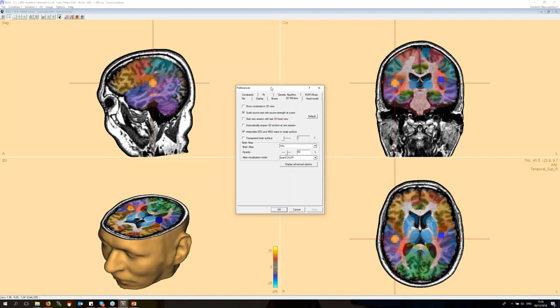And of course, there's a challenge now with the visualization that we have. On the one hand, the source image that we're showing in this brain, and on the other hand, we have the atlas overlay. So we could change the opacity here. We can, for example, put it down to 25%, apply this. And now we have a much better balanced visualization between source image and atlas. So that can be played around with.